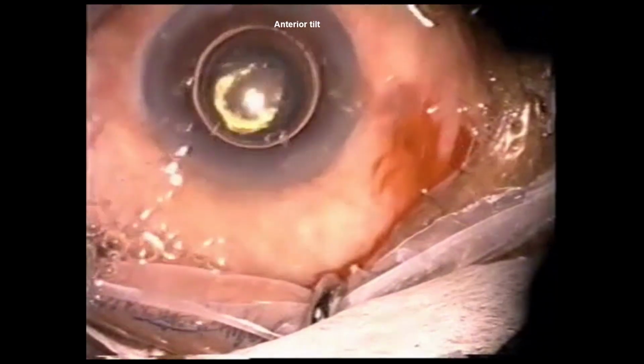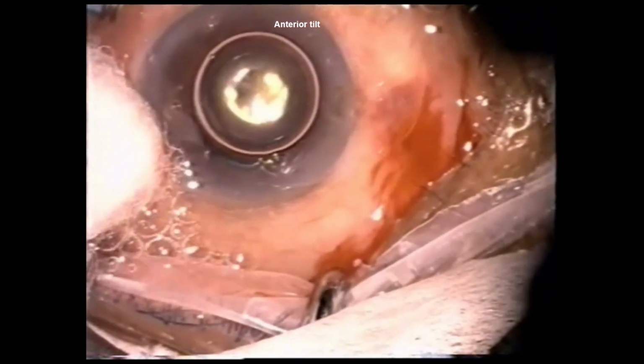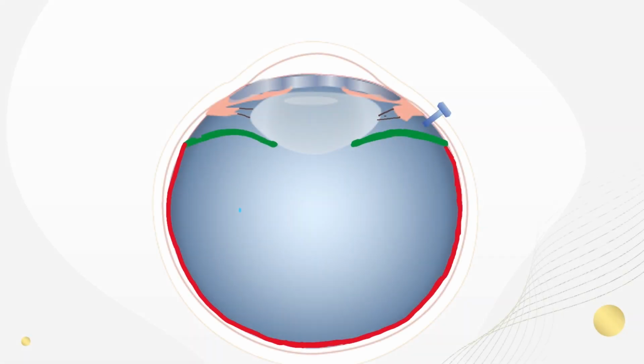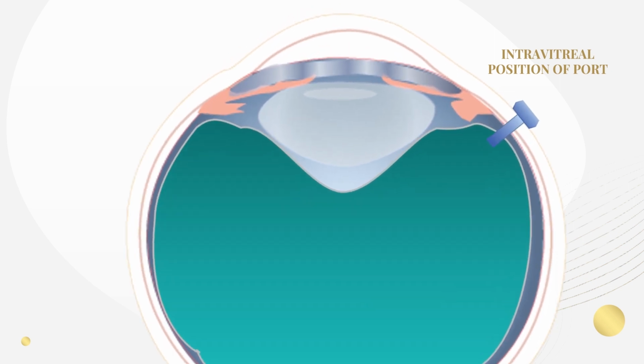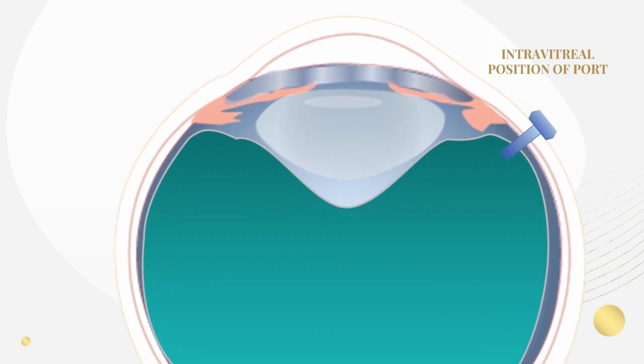When the port is tilted anteriorly, it results in air entrapment tracking through the Garnier space, further migrating into anterior chamber through the zonules. This can result in deepening of the anterior chamber and posterior displacement of the iris lens diaphragm. The infusion of air into anterior chamber evolves quite rapidly as soon as fluid-air exchange is started. In most cases, this necessitates resumption of fluid infusion, removal of air from anterior chamber, repositioning of infusion cannula. This can be avoided by perpendicular orientation of cannula before fluid-air exchange.